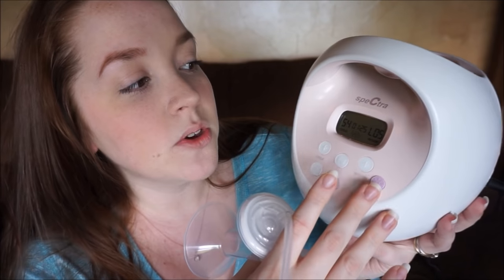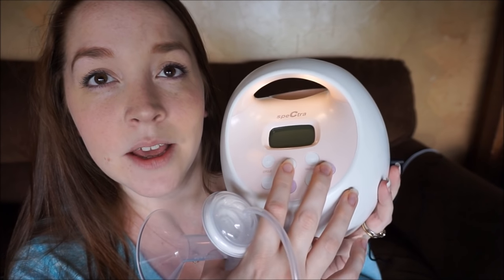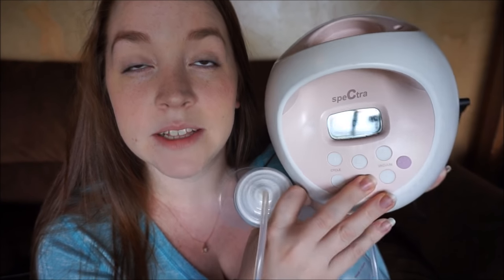I also wanted to show you the nightlight. It's a two-setting nightlight — I won't be able to accurately depict it since it's daytime, but I do really like this. Even though it has a screen, the screen doesn't light up, so during the night when I want to see the buttons and the screen, it's very helpful. When you start the pump, it has a timer and it automatically shuts off at 30 minutes. And back there is the cup holder.